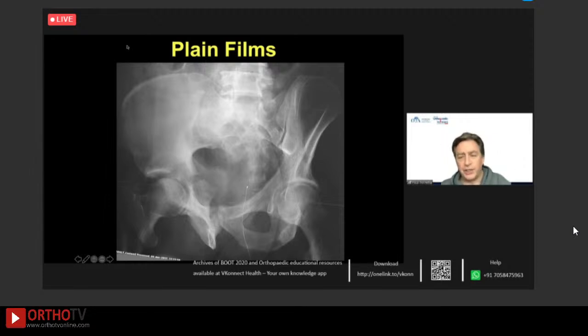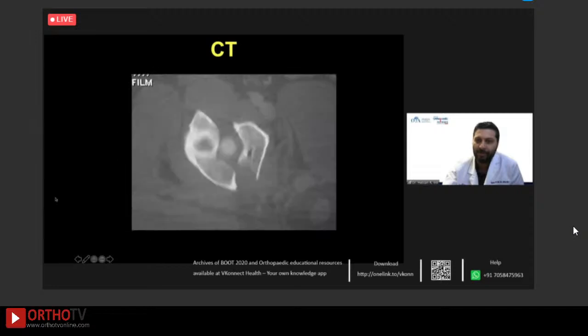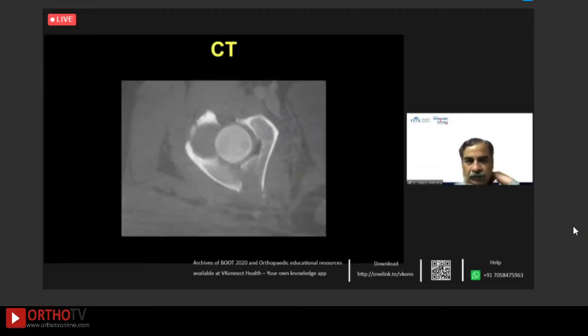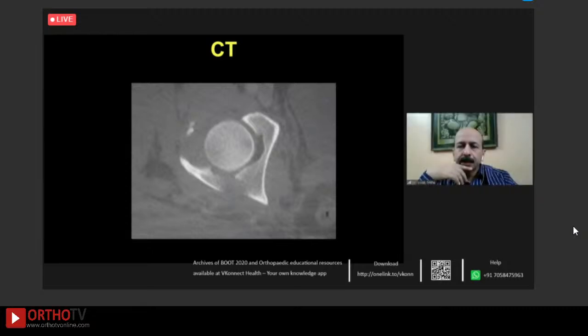Okay. But I had to do that same evaluation. If that was a separate fragment, that would really probably drive my decision a lot more, as to where that fragment is so I can access it and fix it with a separate intra-articular implant. But yeah, I think you could go either way with this, prone or supine, fix the SI joint first to then be able to reduce the transverse.